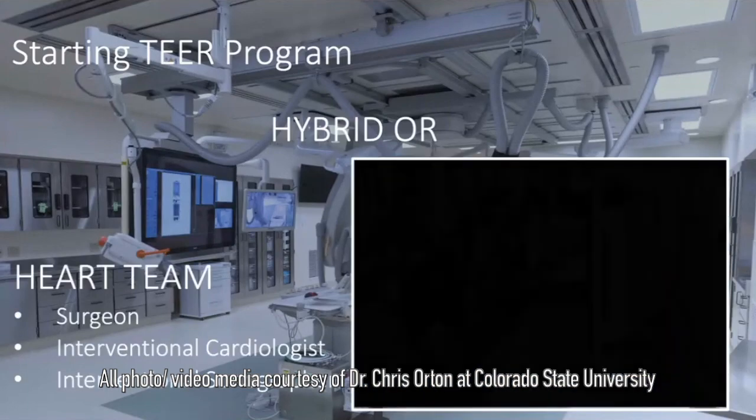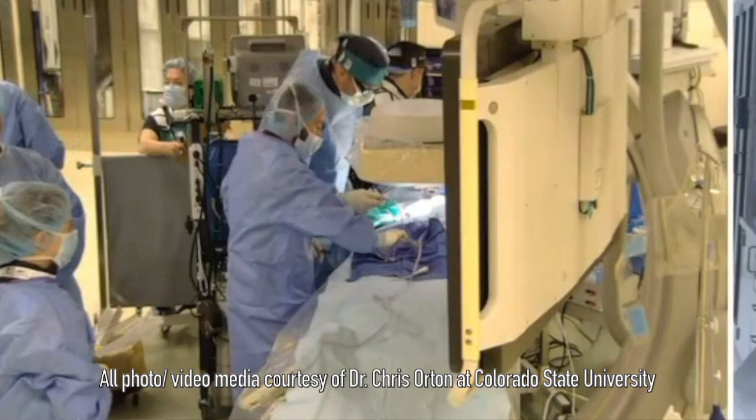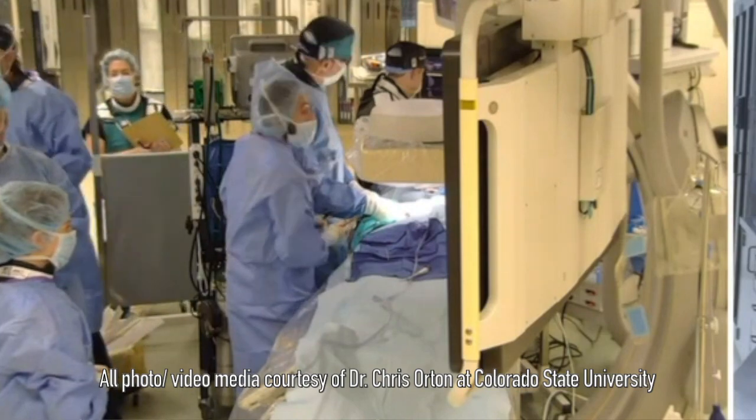This procedure, on the other hand, takes about an hour and a half to two hours. The portion when we're actually in the heart is usually just five to ten minutes. As someone who has done open-heart surgery on small dogs with mitral valve disease, there really isn't anything more invasive or risky. It has very limited availability, it's expensive, it involves international travel, so it doesn't have the ability to help very many dogs.